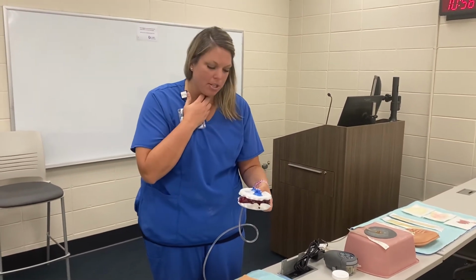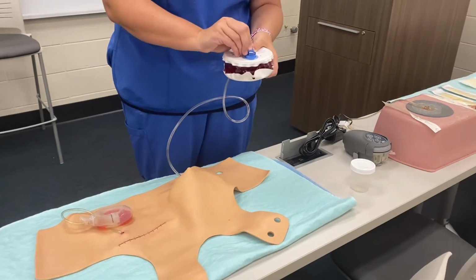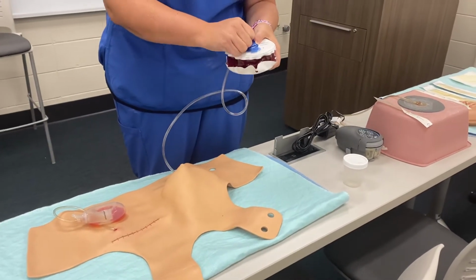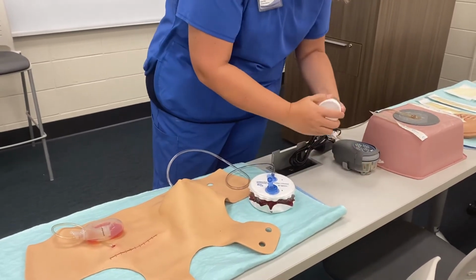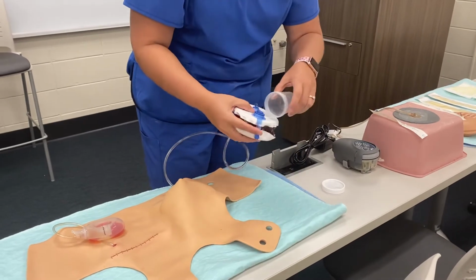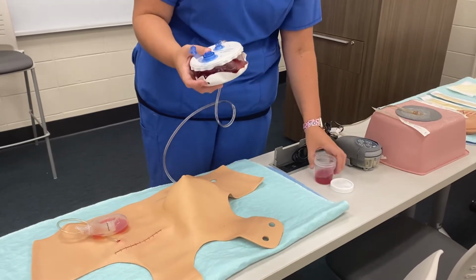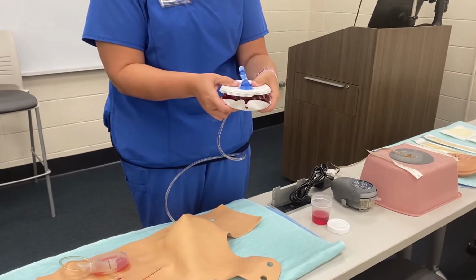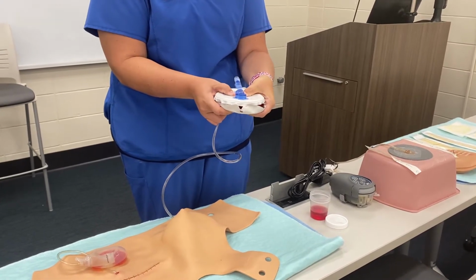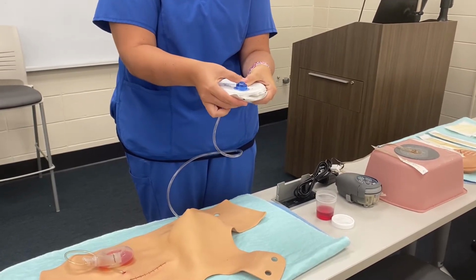So if I was going to go in my patient's room and empty this, I would have gloves on, okay guys? Remember, I don't want to touch this without gloves. I'm going to open it gently. You don't want to spew out any drainage, okay? And then I would have my specimen cup, and I would empty it. Okay, just for the purpose of the video, I'm not going to completely empty it, but I would empty it until there's nothing left. To recompress it, I just gently compress my container and close it, okay?